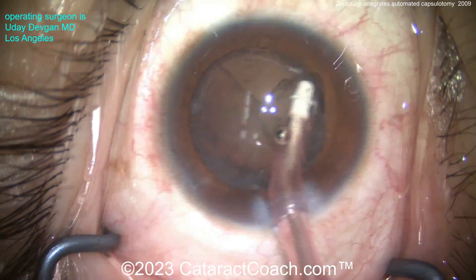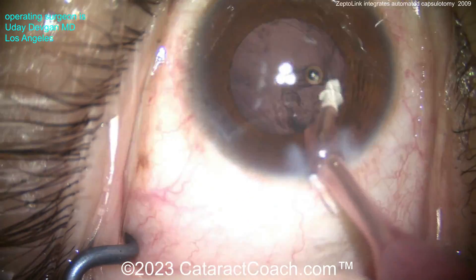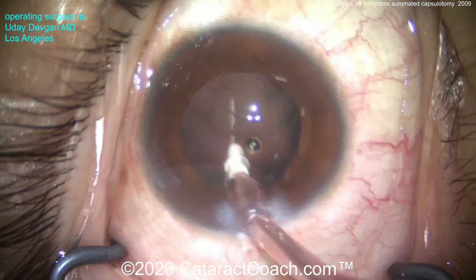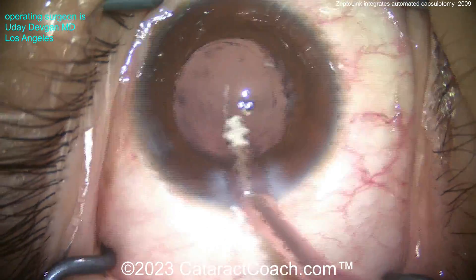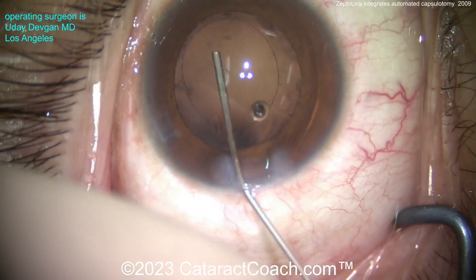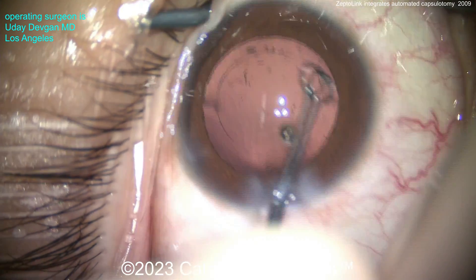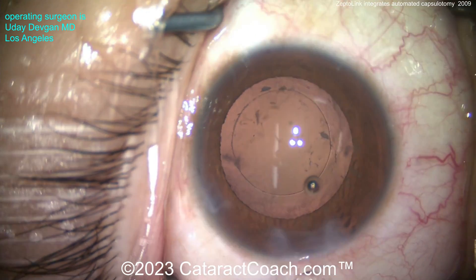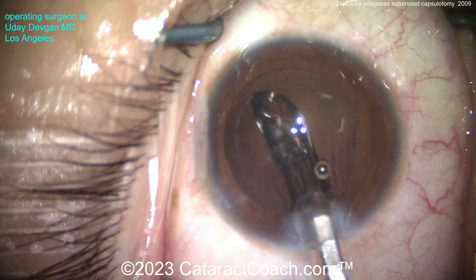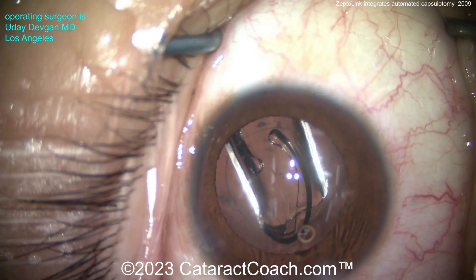The lens removal is the easy part, right? The capsulotomy or capsule opening is the tough part, but removing the lens — which in this case is relatively soft — comes out pretty easily. So we'll clean up the capsular bag and I'll show you how beautiful this capsulotomy is. There's the viscoelastic — you can see it's perfectly round, exactly where we want it centered. Here comes the lens: a single-piece monofocal acrylic lens, and it's a toric one too, so we have to get that lined up appropriately.